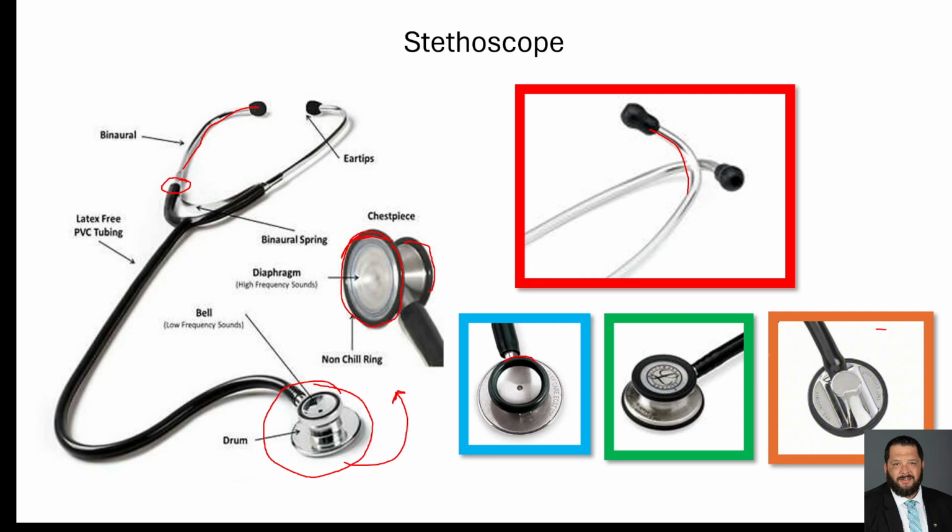Okay. Moving over to the one from the orange, on some of the more high-end stethoscopes, you may have something called a tunable diaphragm, and that's what you see here. That's why there's only one side. So with a tunable diaphragm, and you can see there's places for your fingers to hold here, the back of the head of the stethoscope, with slight pressure.